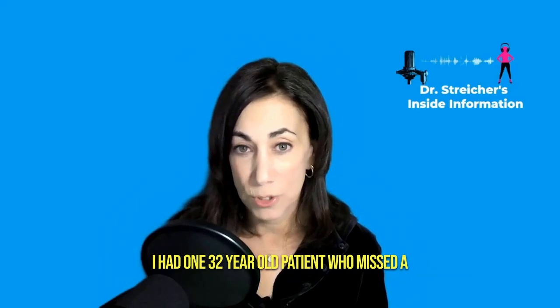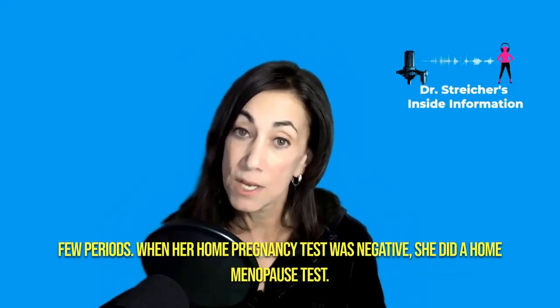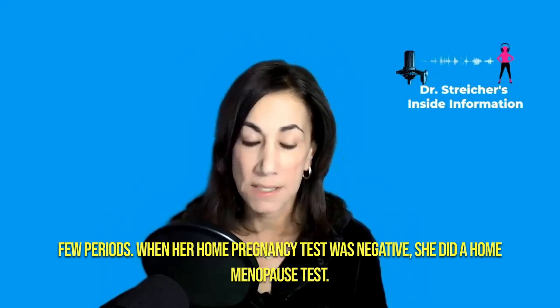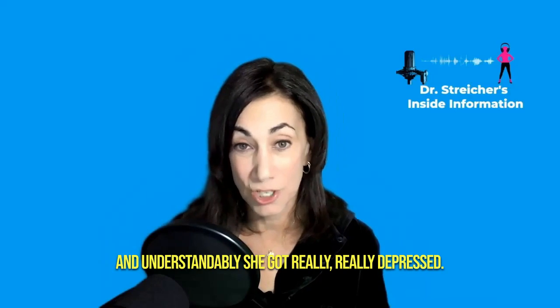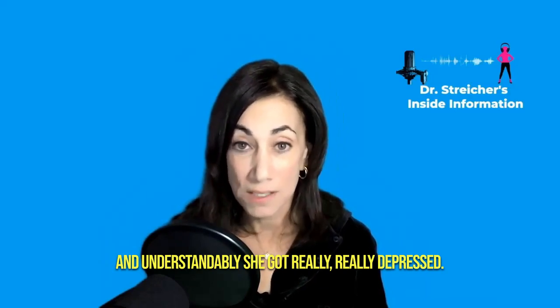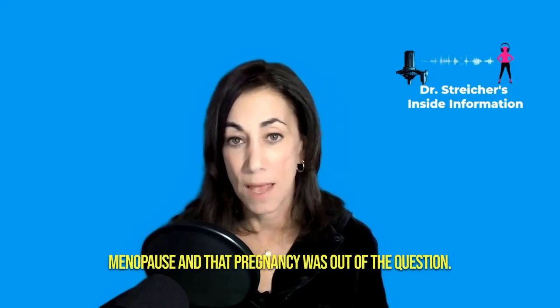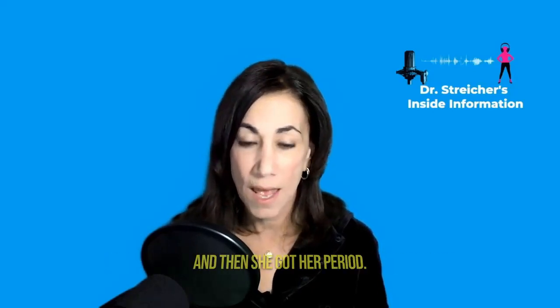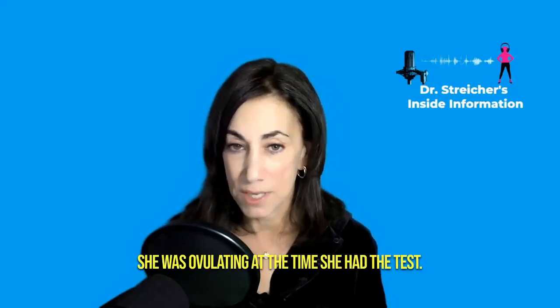I had one 32-year-old patient who missed a few periods. When her home pregnancy test was negative, she did a home menopause test. It came back indicating a high FSH level, and understandably, she got really, really depressed. I mean, she was trying to figure out how to break it to her fiance that she was going into menopause and that pregnancy was out of the question. And then she got her period. She was ovulating at the time she had the test.